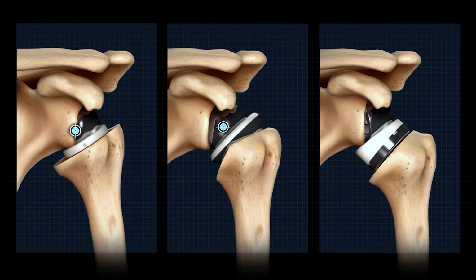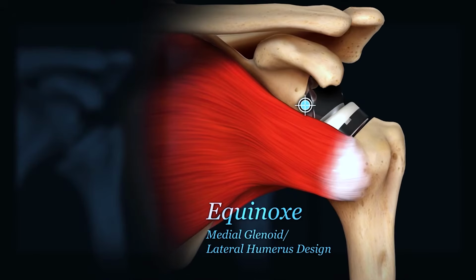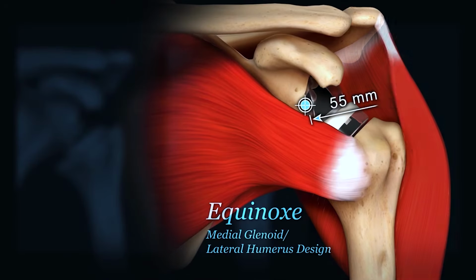Alternative prosthesis designs are available that lateralize the humerus without lateralizing the center of rotation. Doing so better restores rotator cuff muscle tension while maintaining Grammont's deltoid moment arm lengths and minimizing the torque on the glenoid implant bone interface.